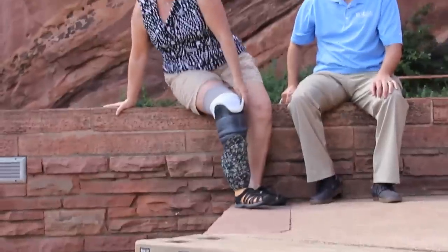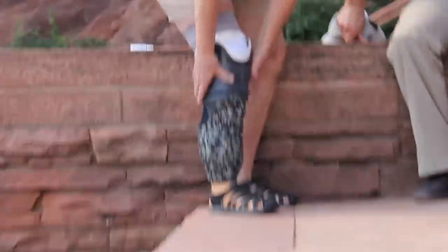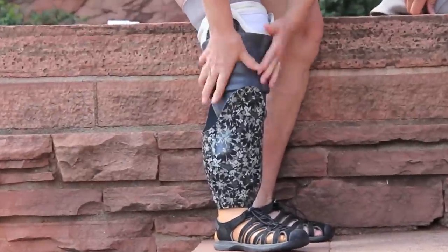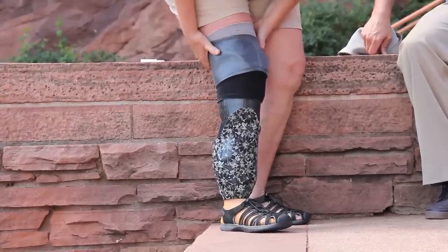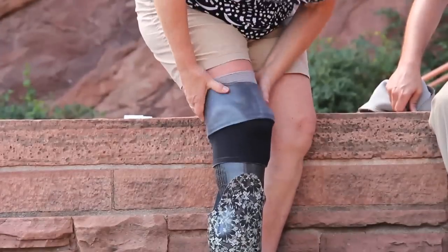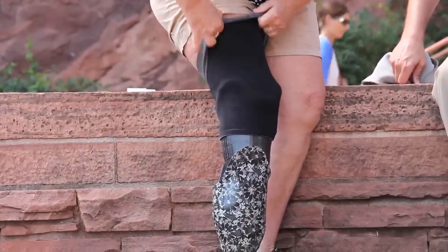On the other hand, if the socket is feeling tight, then reduce your fit by a ply. This process may need to be repeated throughout the day as your limb will change in volume. It is ideal to have the best fit possible with the least amount of socks. For example, it's preferable to have on one five ply sock rather than one three ply and one two ply sock.